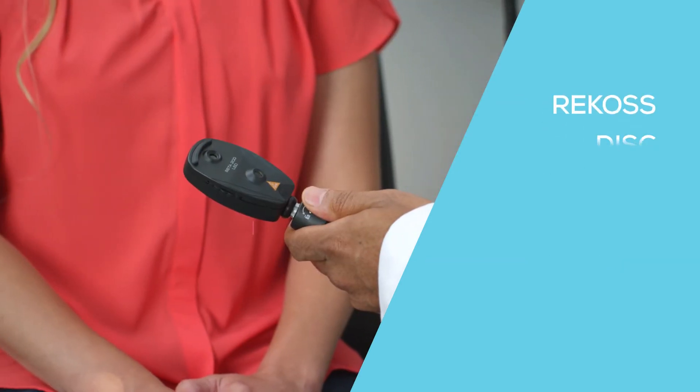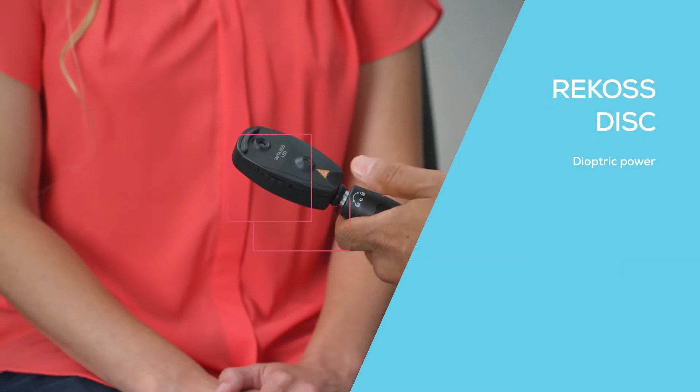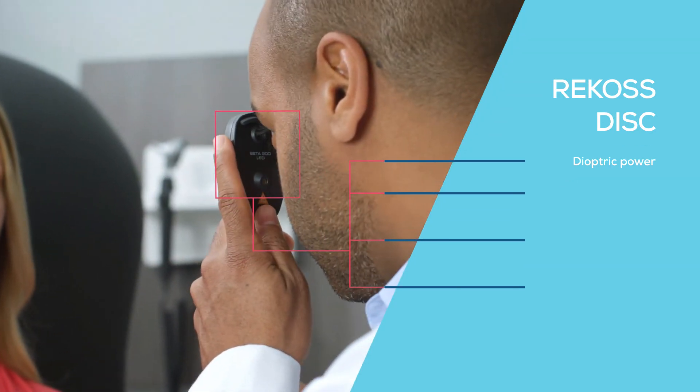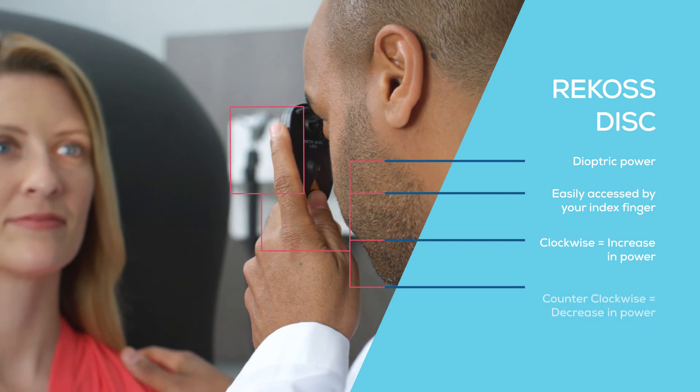There is a Ricos disc lens wheel that displays dioptric power. By positioning your thumb in the indentation at the base of the instrument, the disc is easily accessed by your index finger.